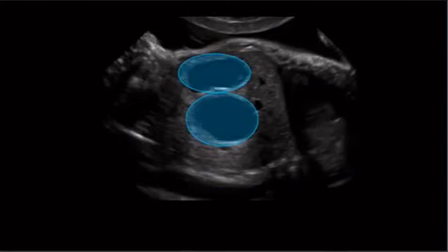All right, next case. All right, we've got two bubbles, double bubble, just like on a plain film, just like on an MRI, you can show a double bubble on a fetal ultrasound. Okay, so what you're seeing is stomach bubble and dilated proximal duodenum, right? Remember that the atresia is slightly distal to that. Remember that the atresia is usually a solitary atresia because these occur from recanalization failure, not from vascular insult like you see with jejunal atresias, which tend to be multiple. There's a Down syndrome association.